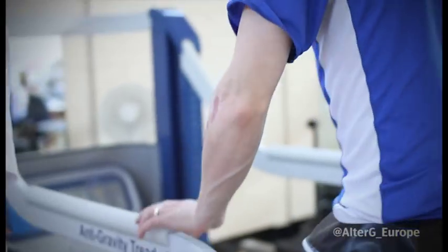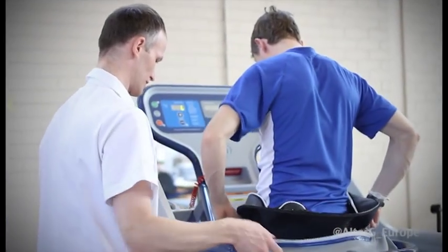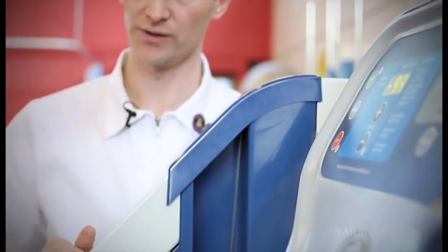We'll get you stepped up into it and then we'll get you all rigged up. Just put it at the level that you're comfortable. So we'll head start and just calibrate it.